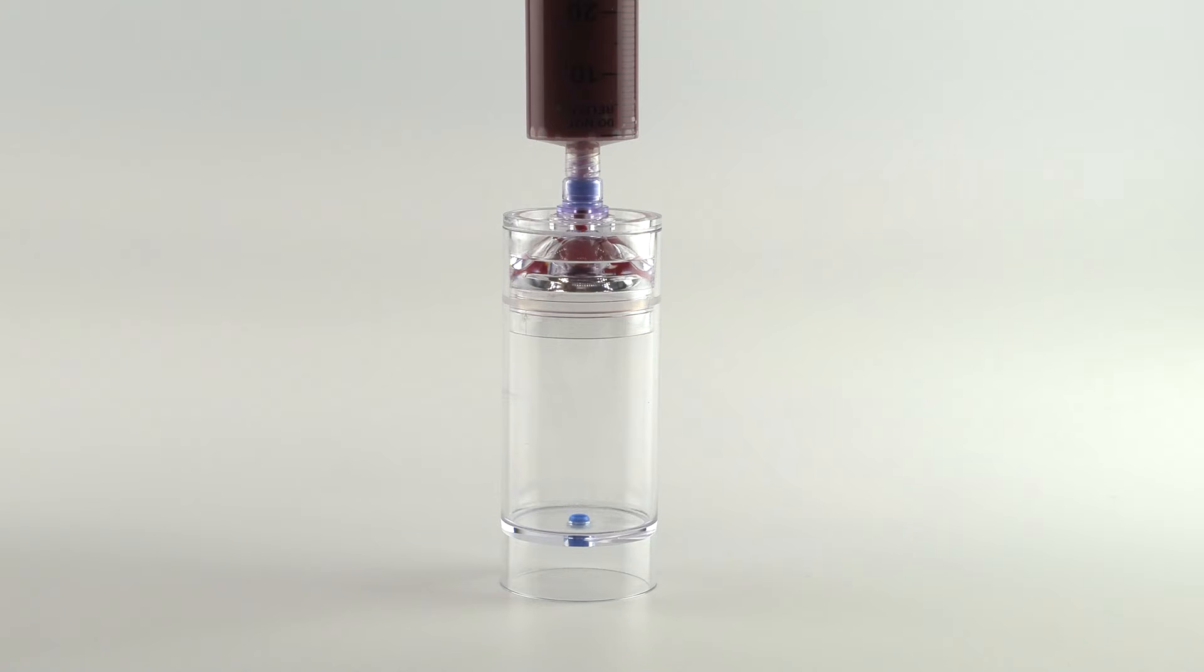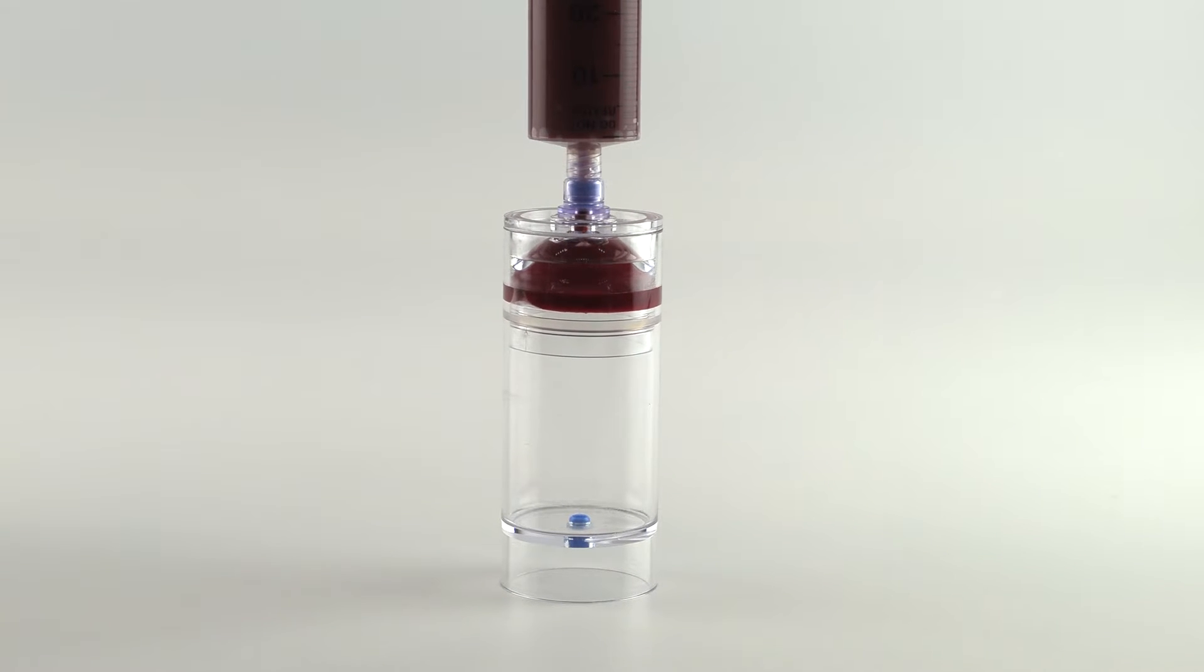Attach the 60 milliliter blood syringe to the needleless port of the separator device and slowly inject the anticoagulated blood.